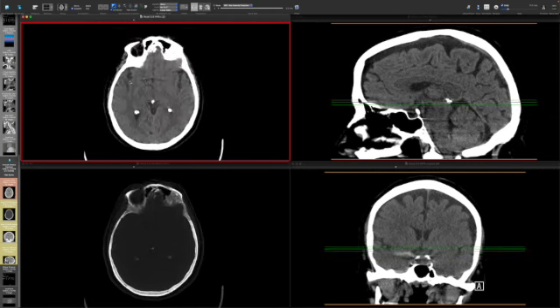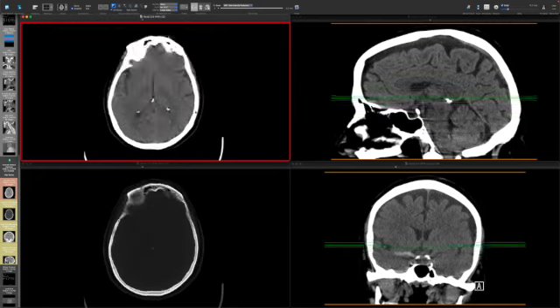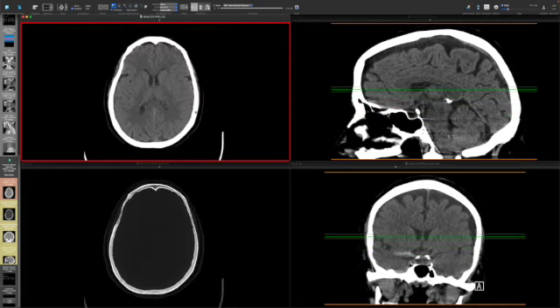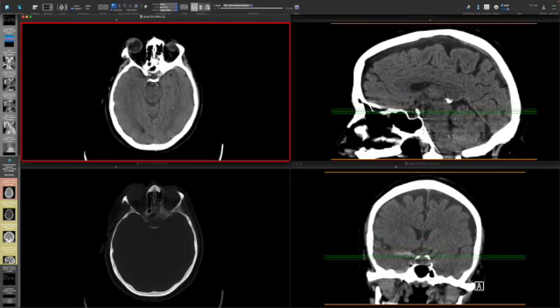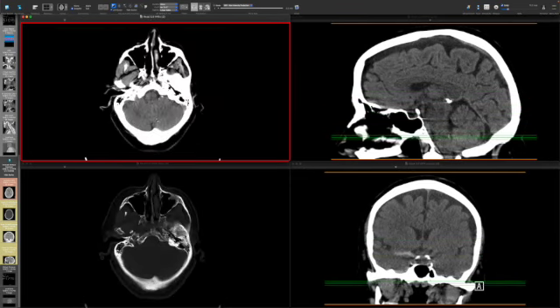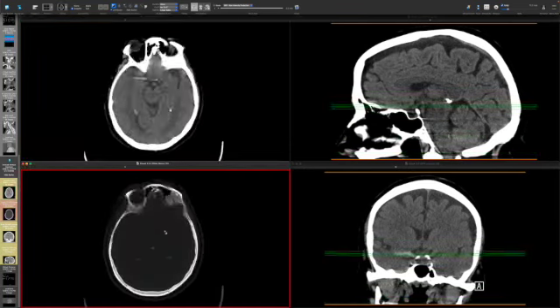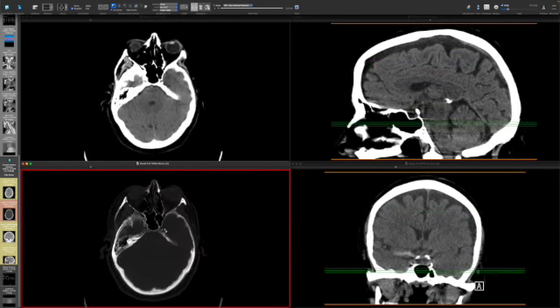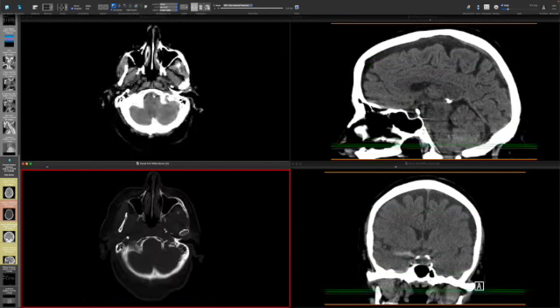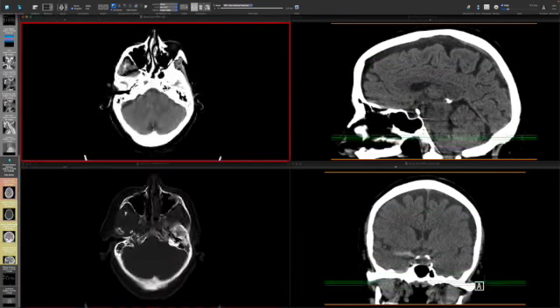So hyperdense right MCA. There's still preservation of the gray and white matter differentiation. There's no mass effect. There's no edema. The ventricular system is normal. The basal cisterns are patent. The posterior fossa looks normal. There's no skull abnormality. And the extracranial structures also look good.